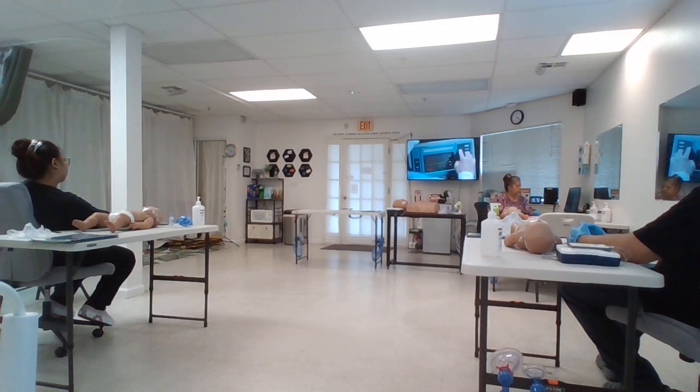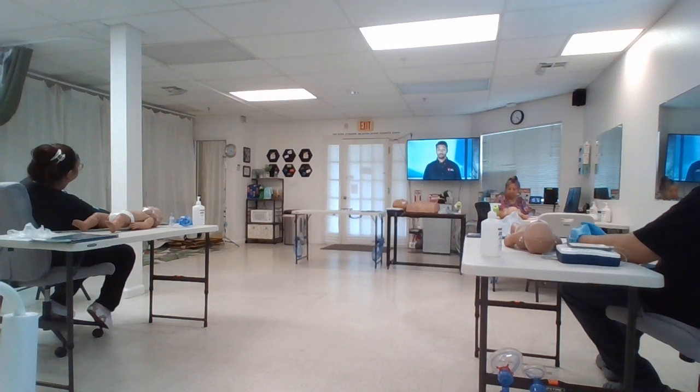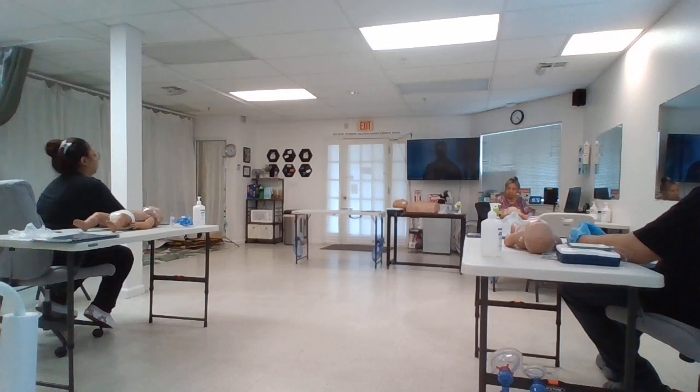If an infant needs defibrillation, a manual defibrillator is preferred. But as we mentioned before, this device is quite different from an AED, and it requires special training that is not included in this course. If a manual defibrillator is not available, an AED with a pediatric dose attenuator is preferred. But if neither is available, you may use an AED without a pediatric dose attenuator.